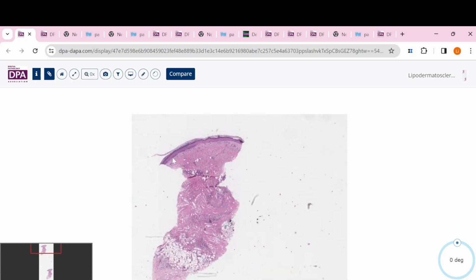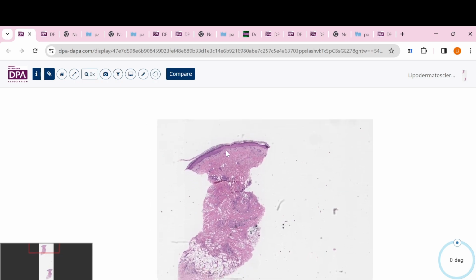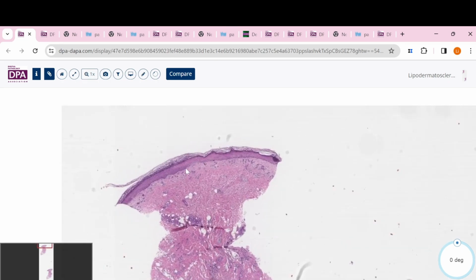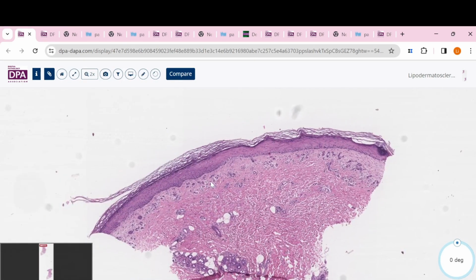superficial dermis, papillary dermis for this one. But when you see this big punch, deep into the subcutis, usually you won't think about stasis dermatitis. You should think about why the dermatologist did this deep punch and included the subcutaneous fat. But when you see the epidermis, if I just show you this picture, it looks really similar to stasis dermatitis.